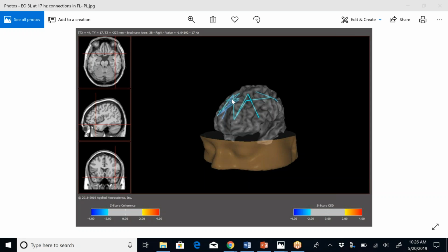So there's different ways to do that, like I said, with different equipment, different collection of data. But ultimately, when you look at the connectivity maps and all the different types of metrics that you can analyze in connectivity, that seems to be where a lot of the prominent problems are, at least in terms of identifying these abnormalities in a diagnostic setting on imaging, within the connectivity tools that we can measure all these different components of connectivity.